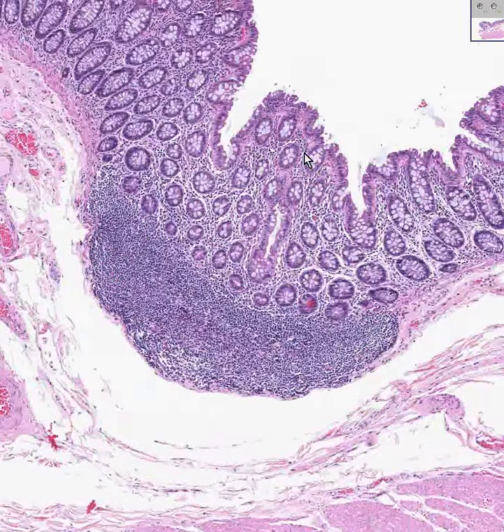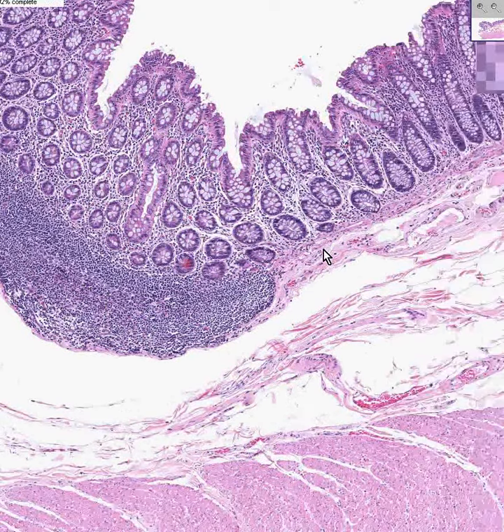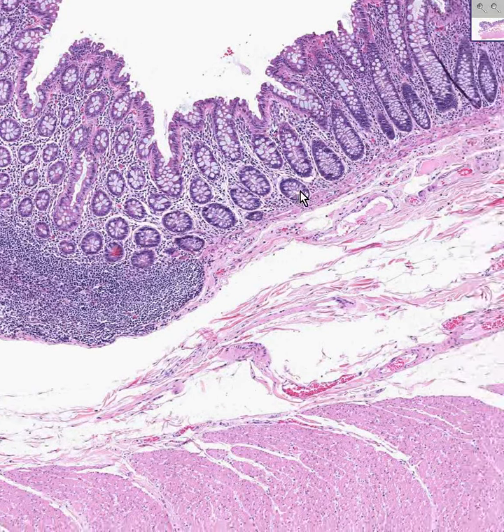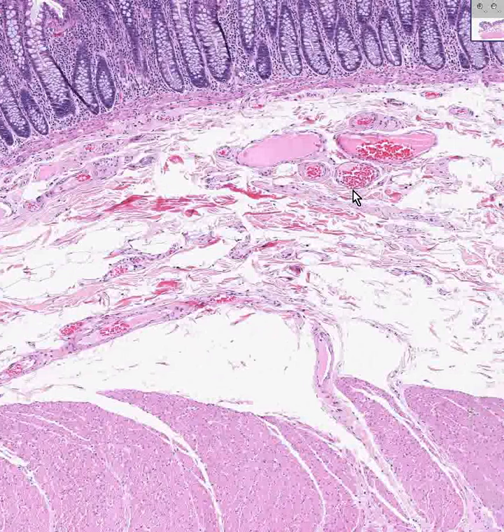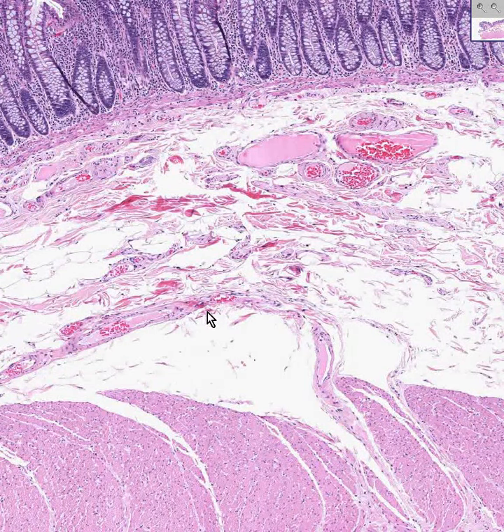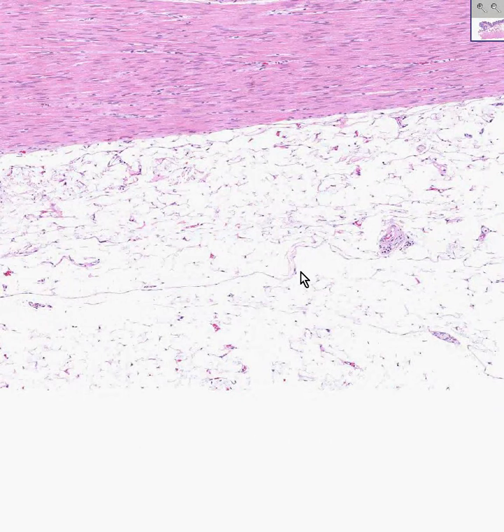Would you like to review it again real quick? Sure, let's do it. It'll just take a second. Surface epithelium, colonic crypts, lamina propria between them, lymphoid tissue in the mucosa, a thin band of muscle called the muscularis mucosae, a thick spongy collection of arteries, veins, fat, and we even saw that one submucosal plexus called submucosa, circular layer, longitudinal layer, myenteric plexus between the two layers, and then the rather loose connective tissue of the outside, which, if this had actual mesothelium, which we could identify, would then qualify it for being serosa or peritoneum. Otherwise, you just have to call this loose connective tissue adventitia.